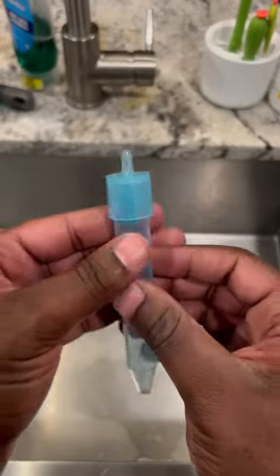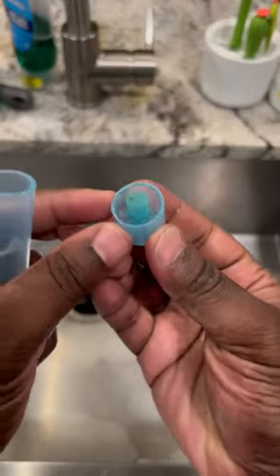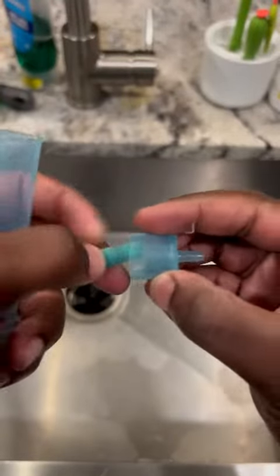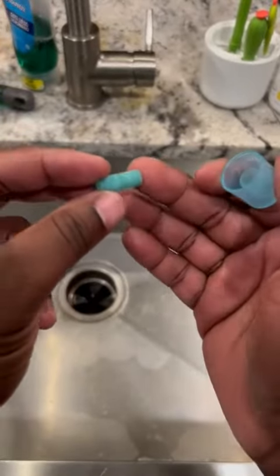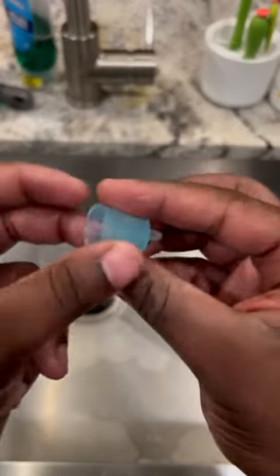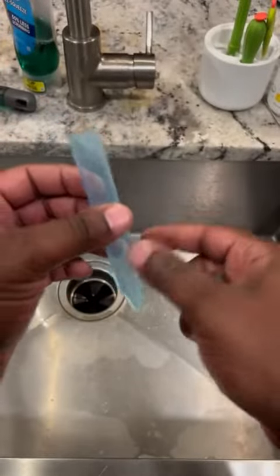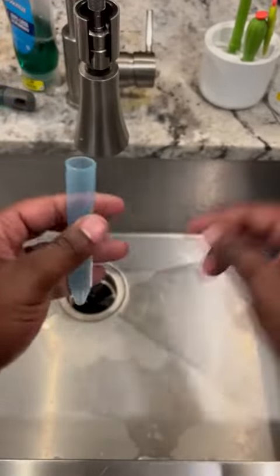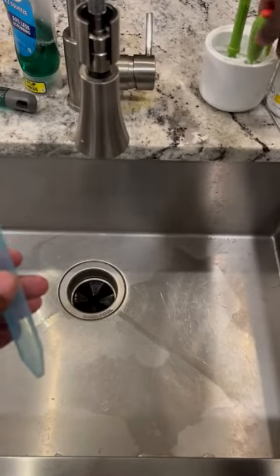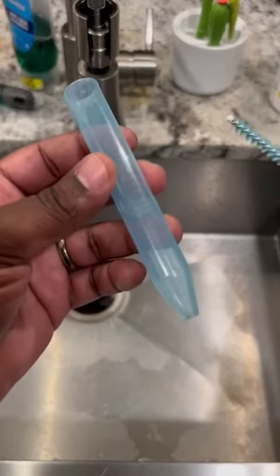When it comes to the actual device, you just pull this off — this is your filter. That's what these little mesh parts are. You can see it gets super dirty, so you'll get rid of that filter and put a new one in. For the base, all you need to do is run some hot water and soap underneath it, and you can use a cleaning brush to make sure everything gets in there.